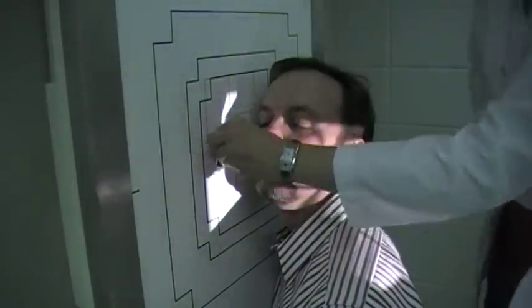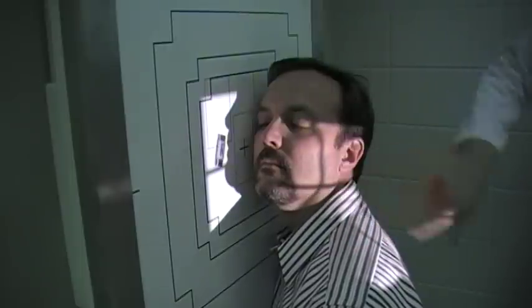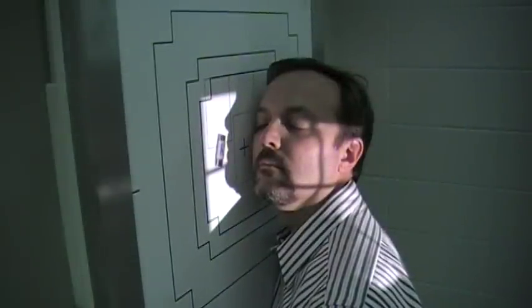Okay, I'm going to put a right marker on here, and I have my central ray entering in at the area of the gonion. So that is our right axiolateral oblique. You would do just the same thing when you're doing your left.